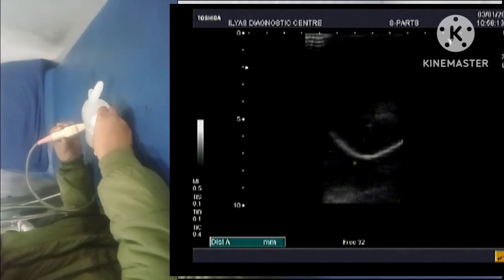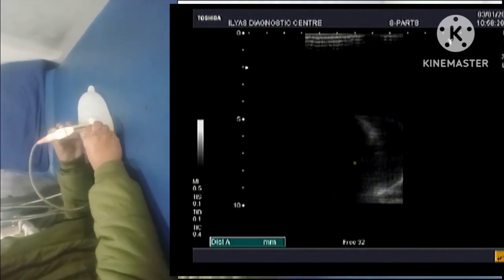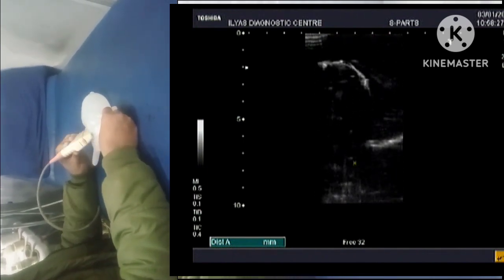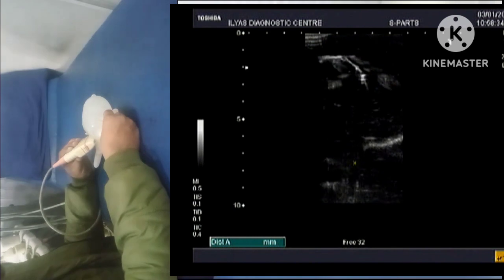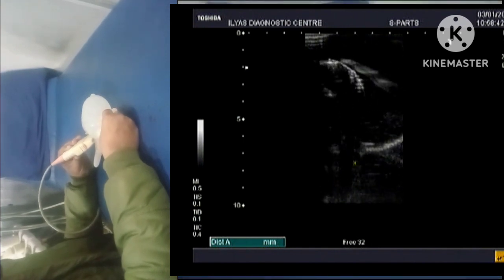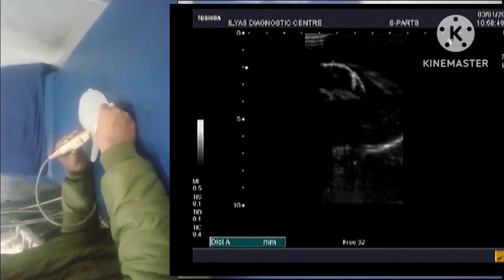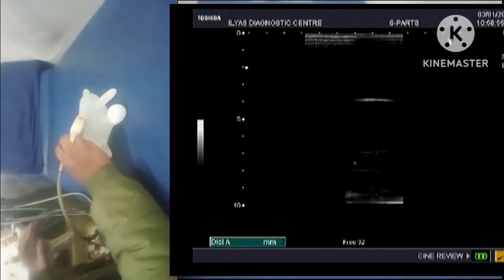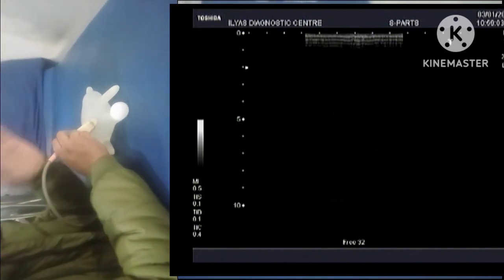Now we will see how gas will appear on ultrasound. For this purpose I will insert this gas-filled finger within this fluid-filled glove. Here you can see this white line is the surface of the air-filled glove finger. You cannot see anything beyond the air-filled structure because it is returning all the sound. However, it is giving a dirty posterior acoustic shadow — please keep that term in mind as I will explain it later. So gas appears white with a dirty posterior acoustic shadow.